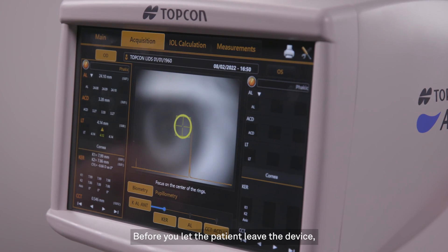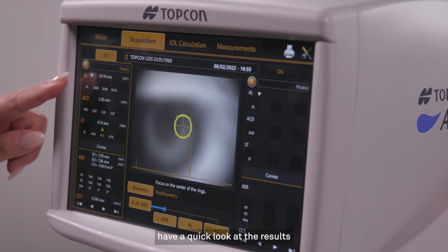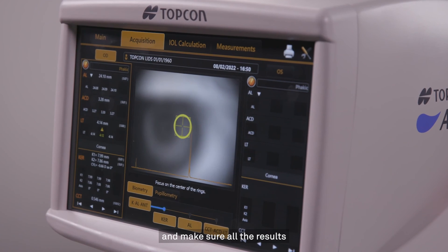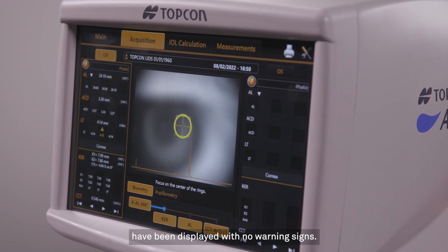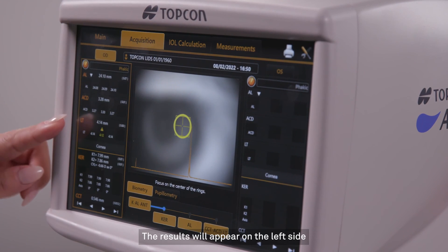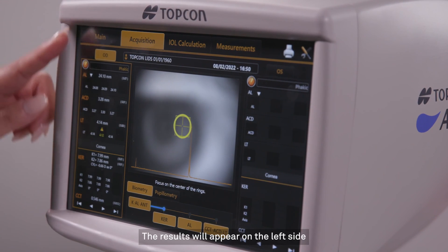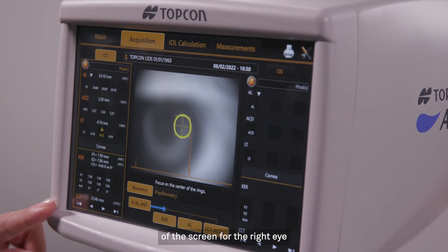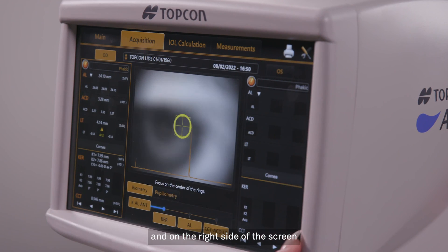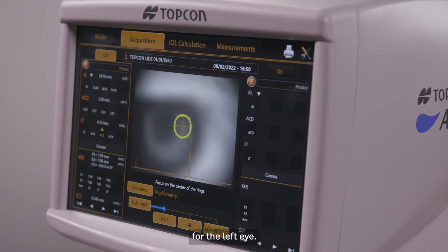Before you let the patient leave the device, have a quick look at the results and make sure all the results have been displayed with no warning signs. The results will appear on the left side of the screen for the right eye and on the right side of the screen for the left eye.